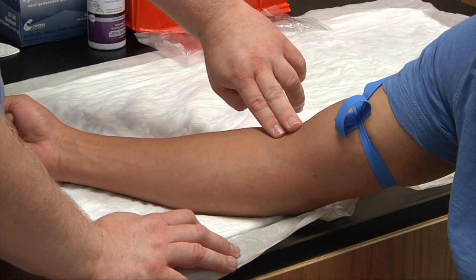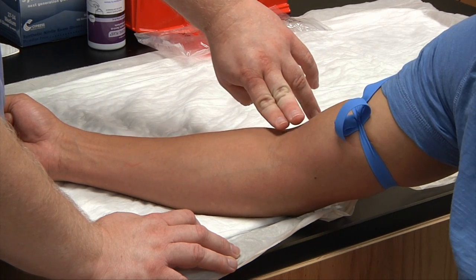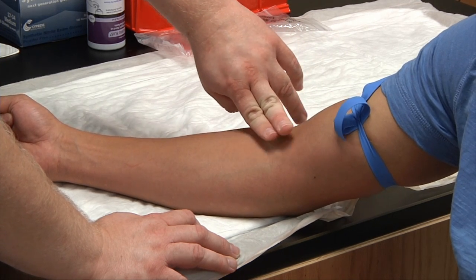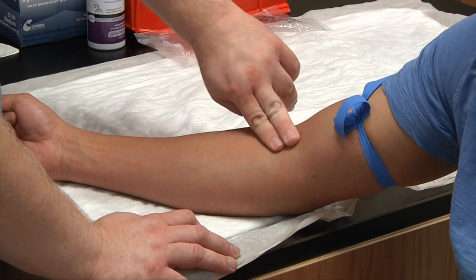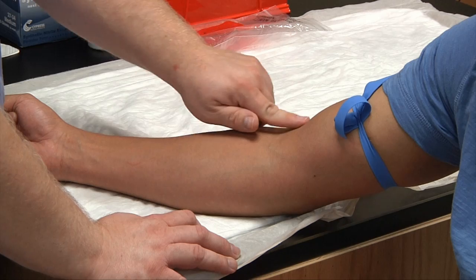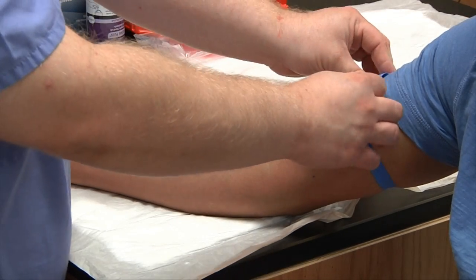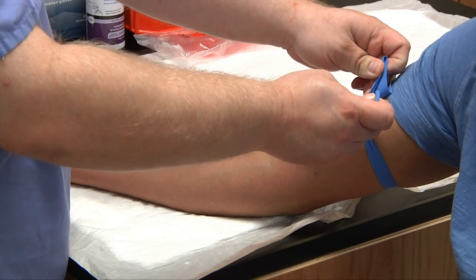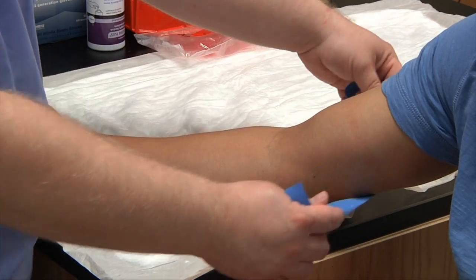On your first sweep, you're just seeing what the patient has. Then you'll pass through again, determining if you have a vein, artery, or tendon, and choose your selection site. With this patient, I'm going to go right here with this vein. Then you'll release your tourniquet and prepare your supplies. This has been tourniquet application and palpation.